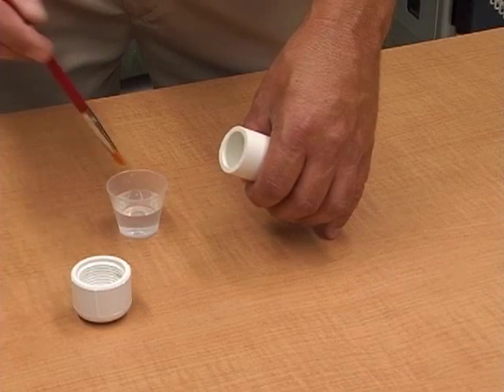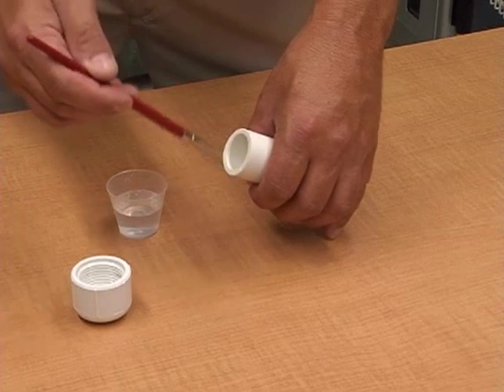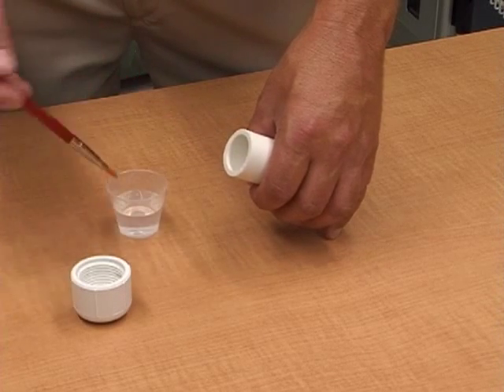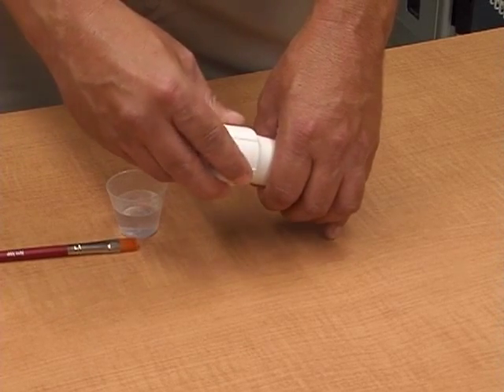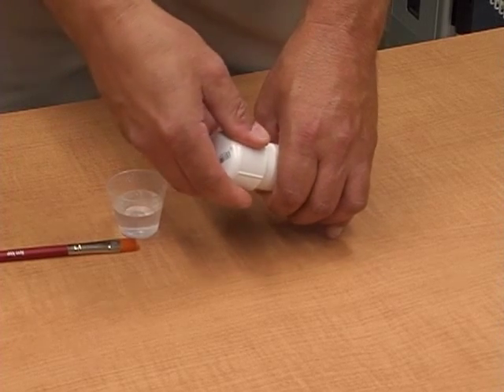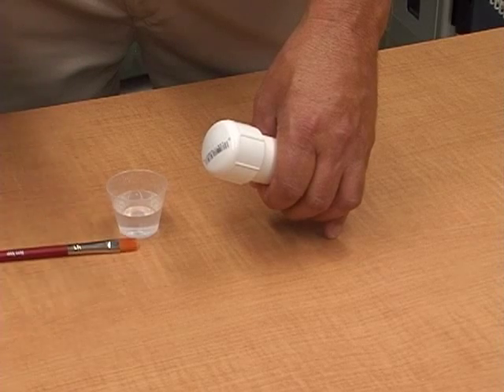The first and easiest thing to do is take your one-inch diameter pipe, put some PVC cement around the outside of it, take your end cap, and attach it to the end of your pipe and let it dry. Usually takes a few minutes — set it down and go back to it in a minute.